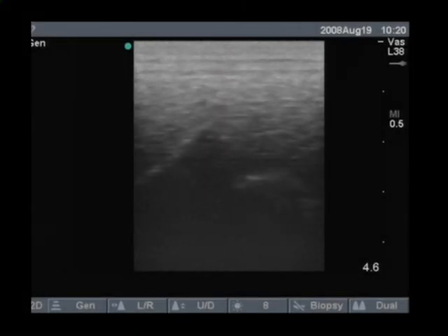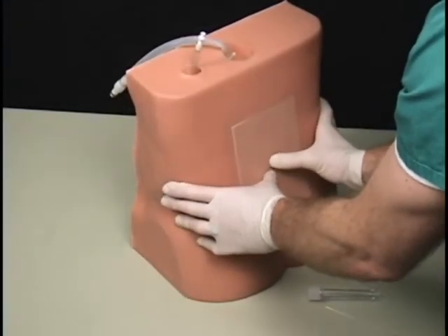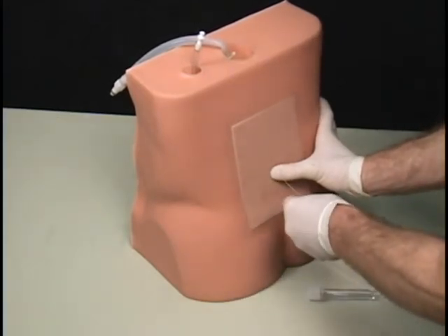When viewed under ultrasound, the pertinent spinal anatomy can be identified. When using a blind technique, the trainer's landmarks can be palpated, including the iliac crest and spinous process.